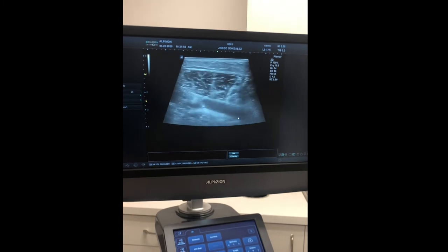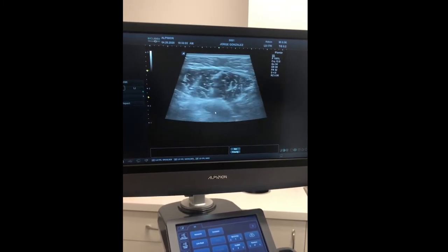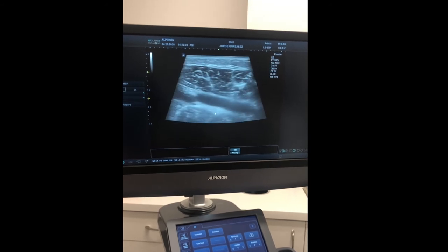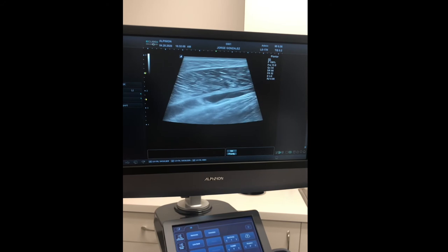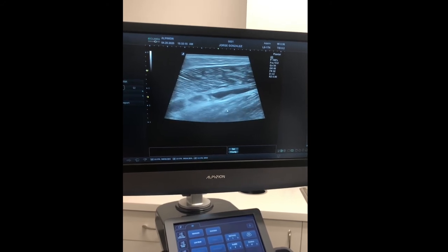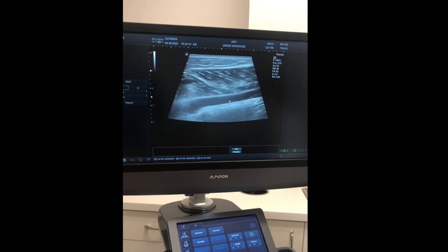I'm going to increase the depth here. The tear actually traces all the way up proximally, almost all the way behind the knee. If I turn my probe longitudinal, we can actually see the detachment of those two layers of muscle — muscle here, muscle down here — and we have all of this fluid here, which we call the hematoma, where the tear happened.